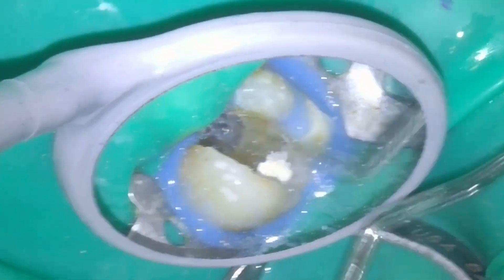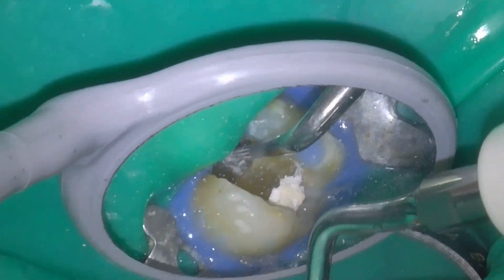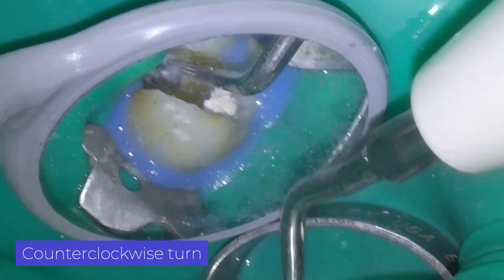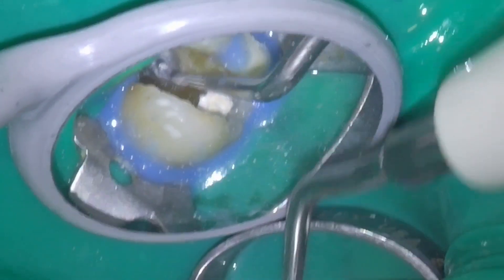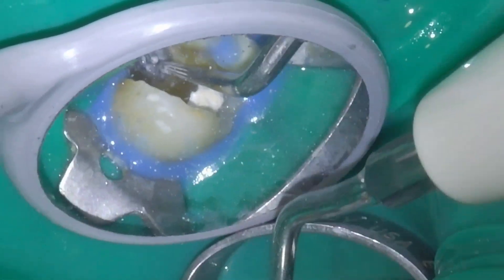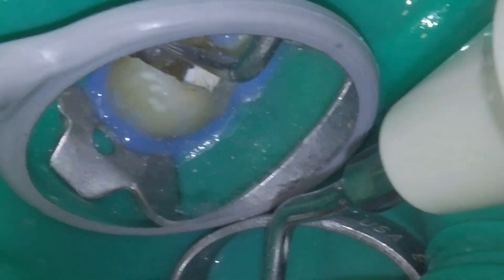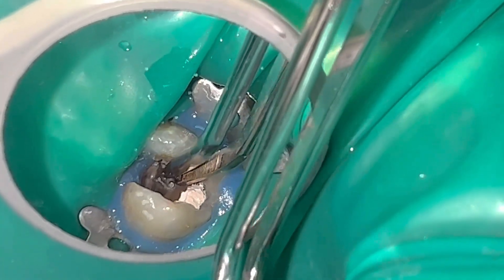You have to work for a maximum of 15 seconds without water to avoid damaging the tooth. After a while, we were able to move the file outwards only with ultrasound, and then pick it up with tweezers.